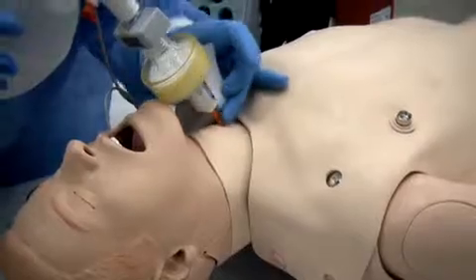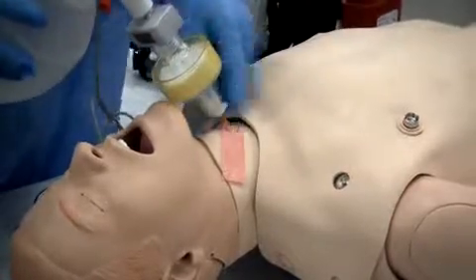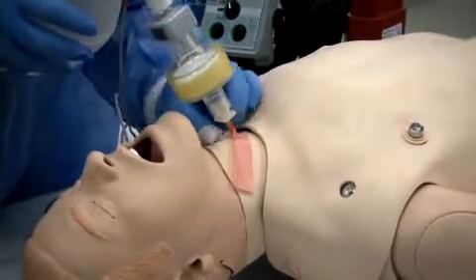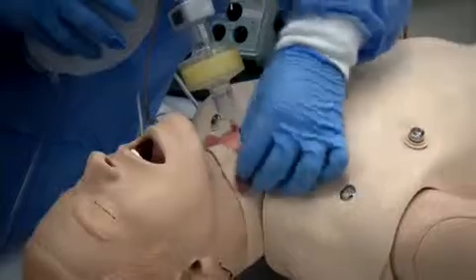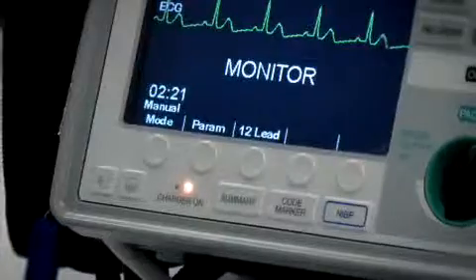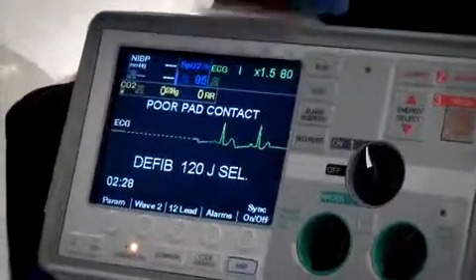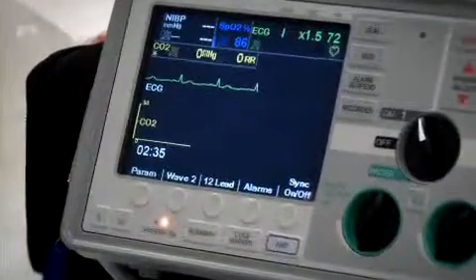Once placement is confirmed, secure the catheter in place. Ventilating through a 14-gauge needle will require constant attention, as there will be noticeable increase in airway resistance due to the size of the catheter, and the chest relaxation and passive exhalation of the patient will take longer.